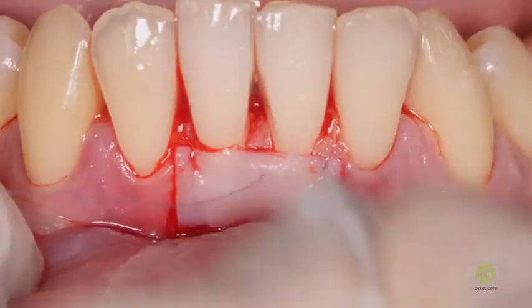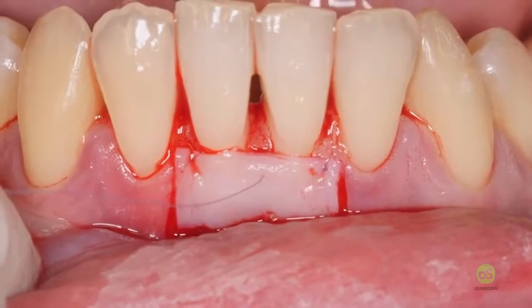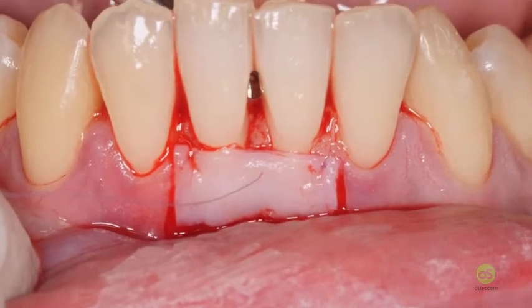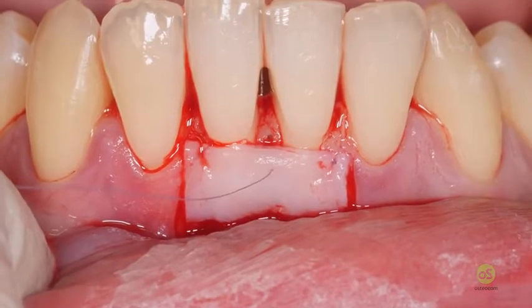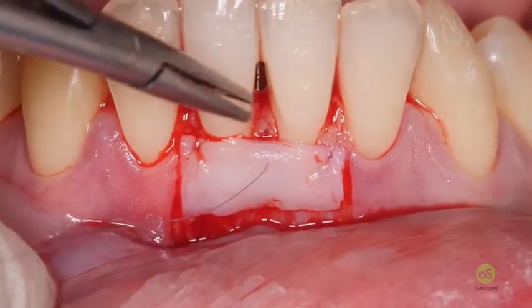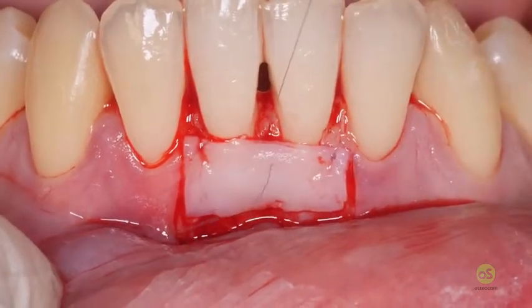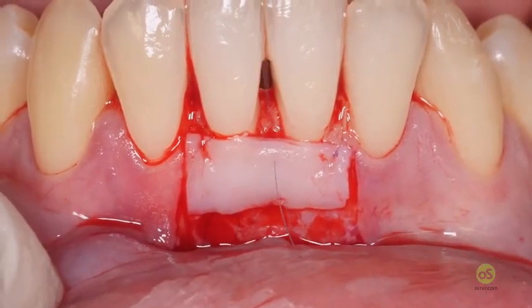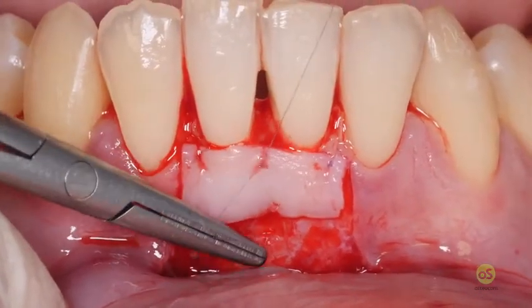Then with a horizontal mattress I perforate the papilla from the lingual aspect and get out at the base of the desepithelialized anatomic papilla with the needle. You see here, I get out here. So when I'm closing the surgical knot now, there shouldn't be any graft on the papilla, but at the same time the graft is well sutured to the base of the desepithelialized anatomical one.